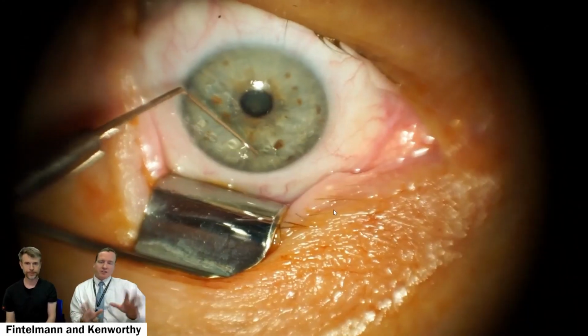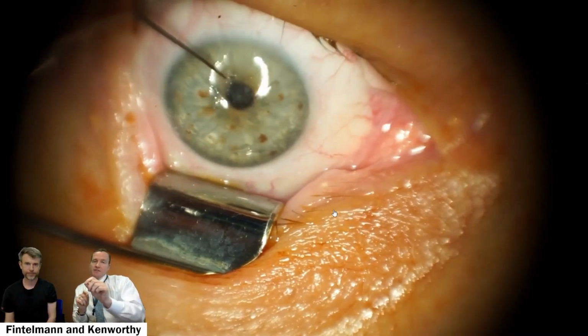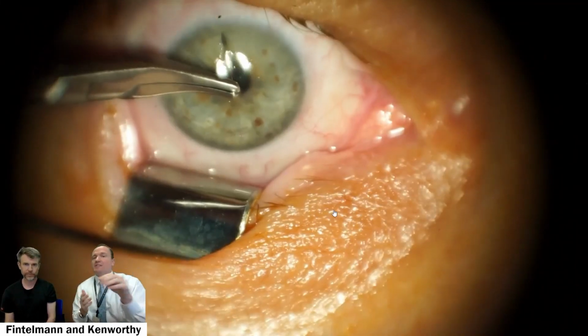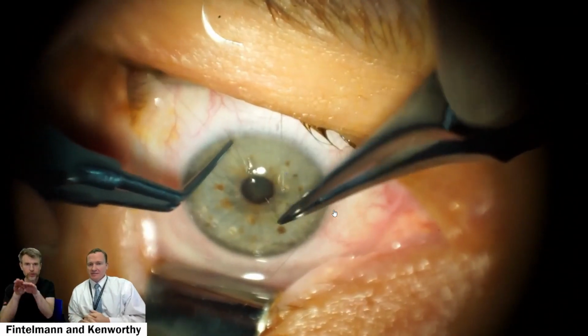Now, this video is a very short 2-minute video, but I think there's a lot to learn from it. First step, I noticed that through those wounds, it looks like you're actually opening them up more. Opening them up, removing the epithelium so that I can close them better.